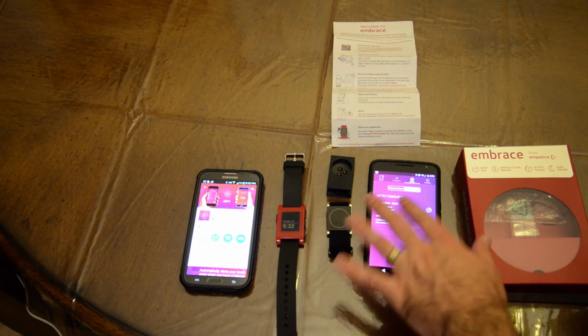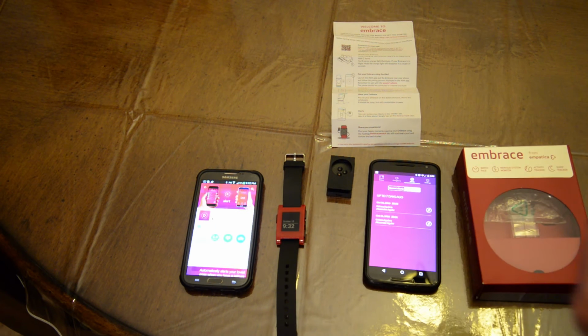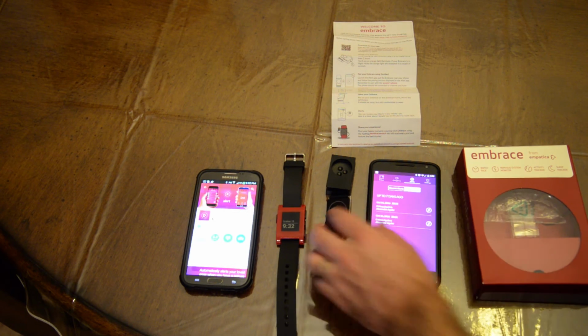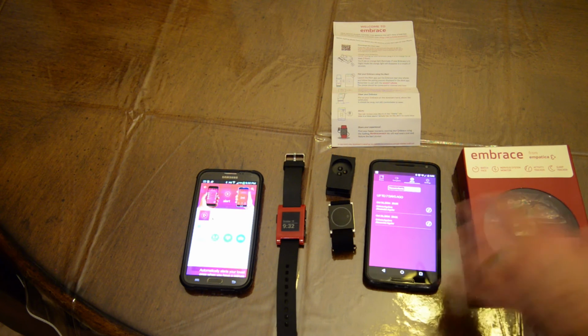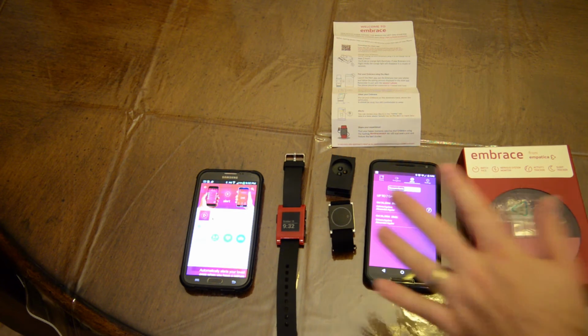The difference between this one and the Pebble is it does have these sensors in the back that track the nervous system, as well as heart rate and other things that will be beneficial to get more accurate settings. Unlike the Pebble, which only tracks motions, this one will track more than just one setting in order to give off an alert.